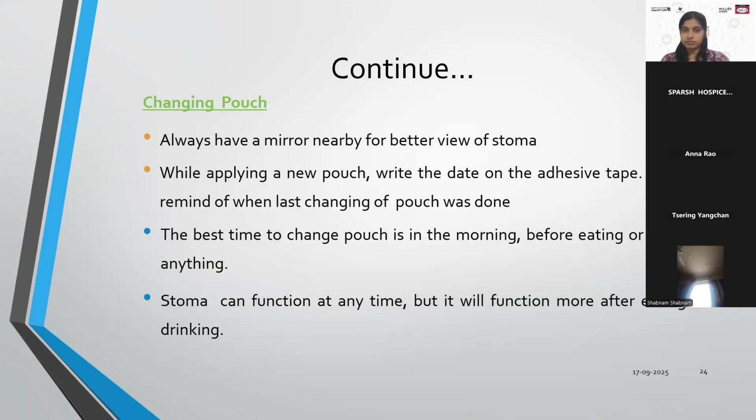Next slide. Yes, so here you can see on the left side the healthy stoma. Middle figure shows the two types of stoma bags. On the left side is one piece bag. On the right side there are two-piece bag. In one piece bag, the sticker is right on the bag itself. So when they are cutting it, they have to be careful. There should not be any kind of zigzag in the peripheral area of the bag from where it is cut. It should be good round in shape. Otherwise, the cut edges will poke the skin area, which is very sensitive.